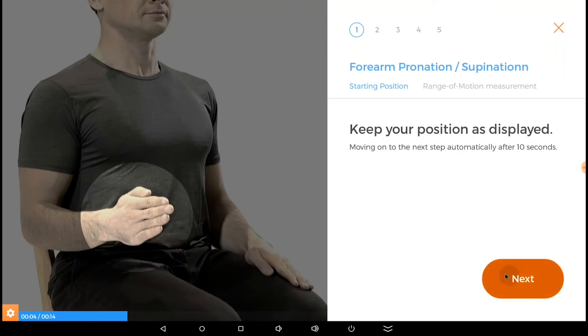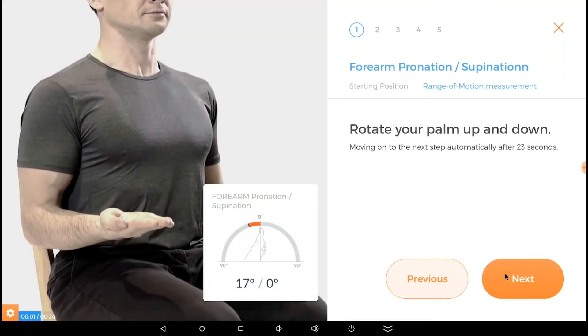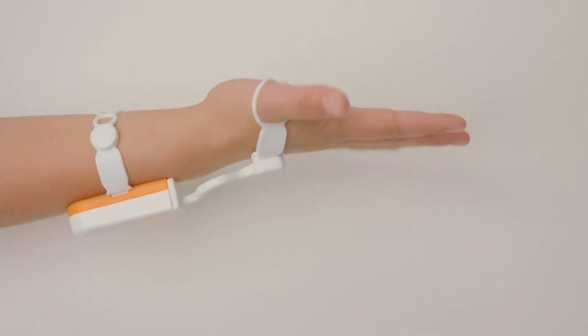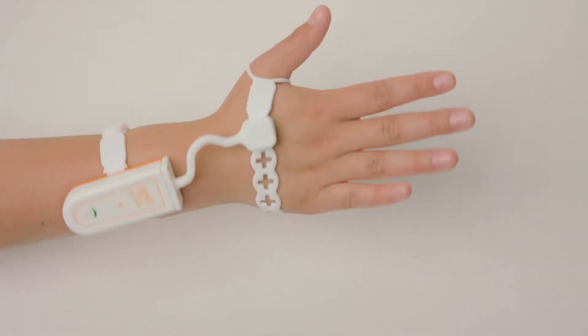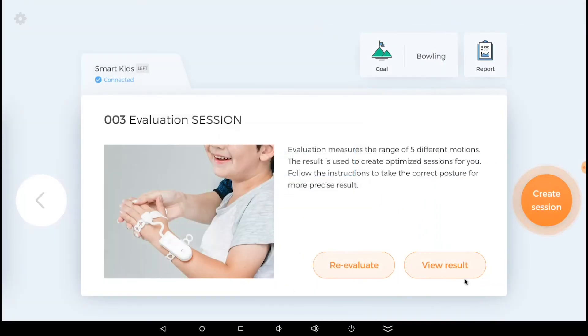The prompts will guide you through the starting positions and movement patterns required to record data for the three dynamic wrist movements. Once you have completed the evaluation, the program will prompt you to begin a training session.